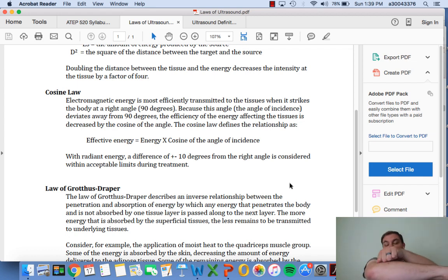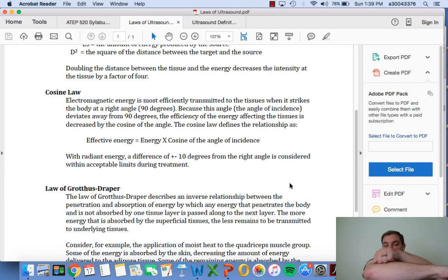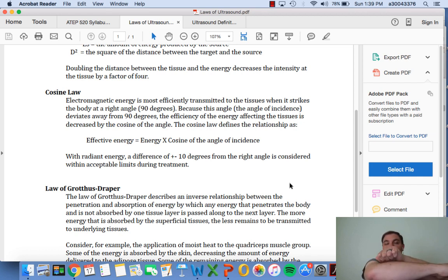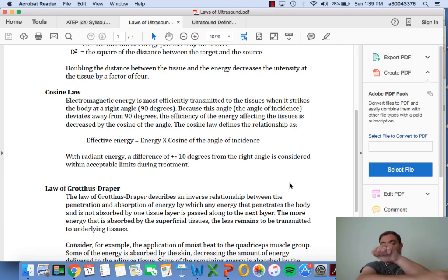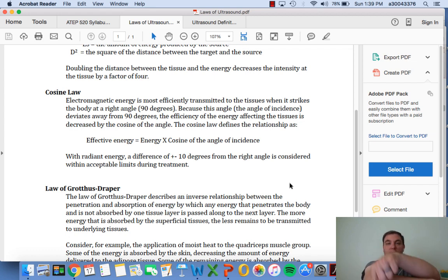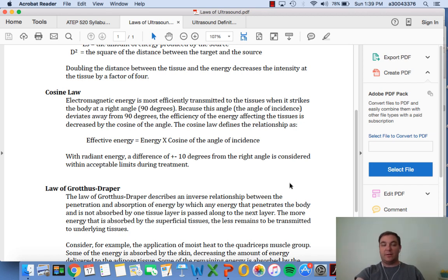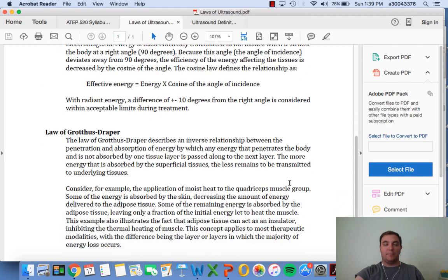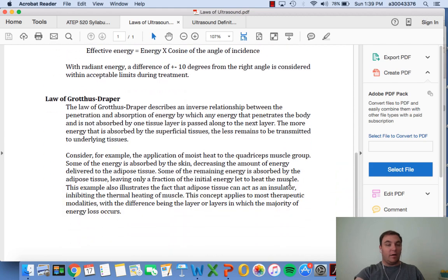If using ultrasound on my arm, I want to keep the ultrasound unit flush on my skin at a ninety-degree angle - flat. If I raise the ultrasound up, only the beams in contact with my forearm are getting into the body; the waves near my knuckles are going toward the computer and table, not hitting the skin. So ultrasound becomes less effective. And the Law of Grotthus-Draper - I think we know this law by now.